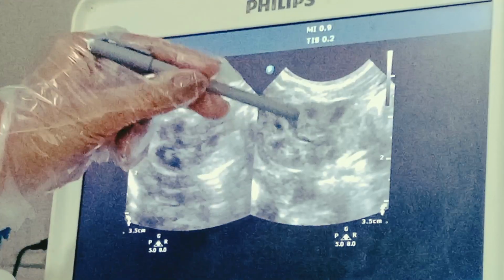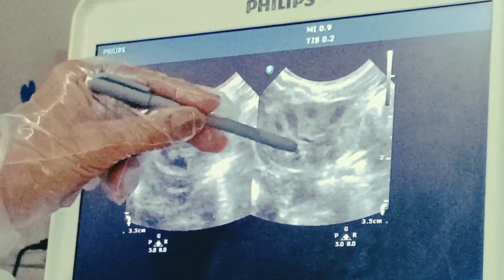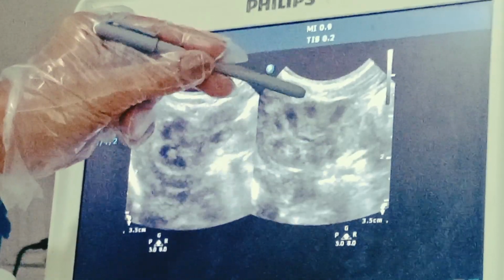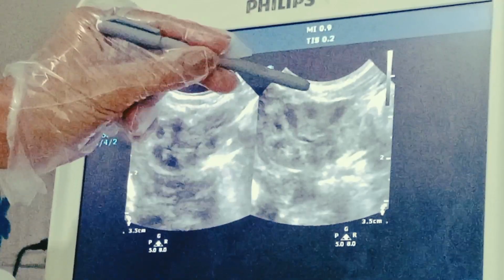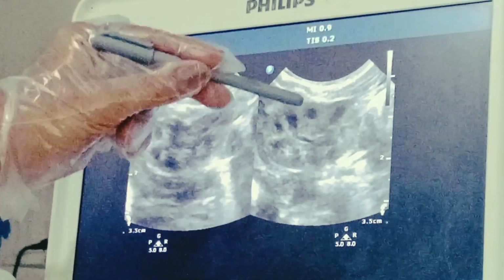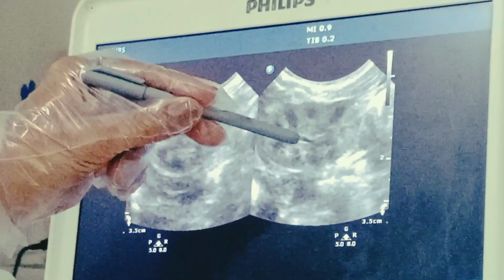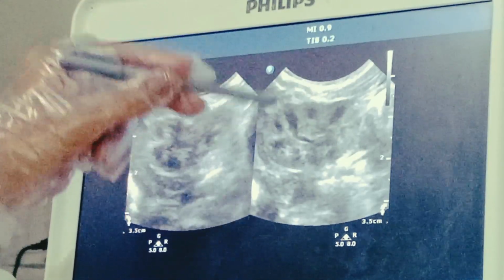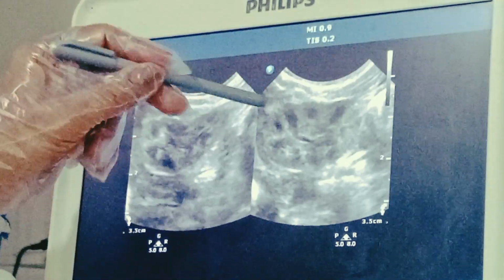The medulla is almost hypoechoic and anechoic because it doesn't have fat. The cortical to medullary ratio is around 1.56 to 1 in neonates, whereas in adults it becomes 2.59 of cortex to 1 of medulla. So the newborn has more medullary area compared to the adult population.